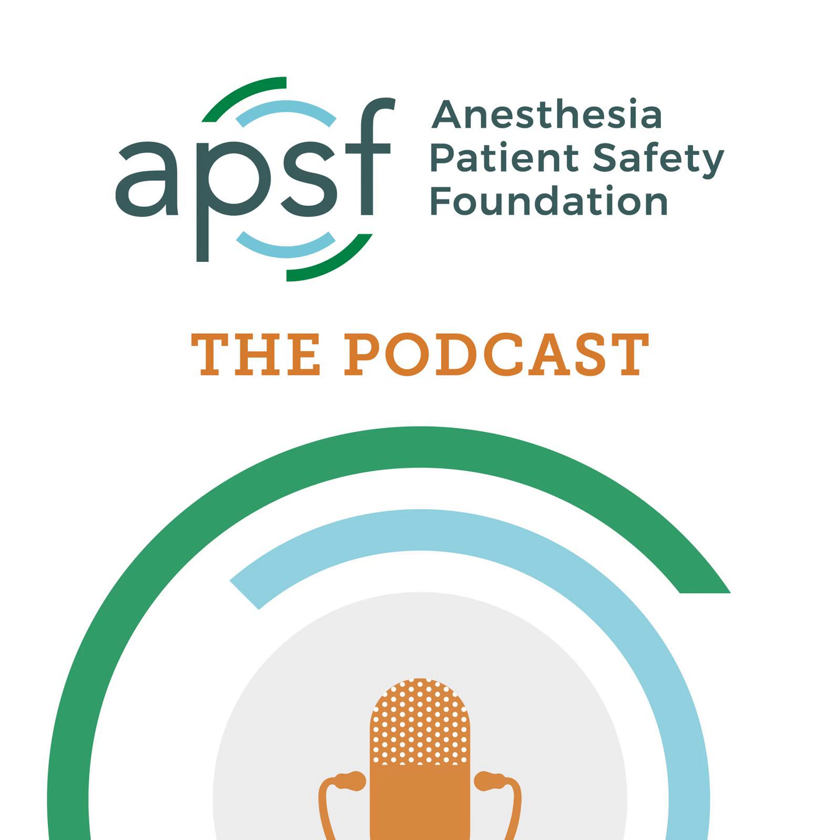Do you have your answer locked in yet? Are you ready? Today, we will be talking about the Laryngeal Mask Airway, or LMA. This device may be used as part of the difficult airway algorithm and may also be used as part of routine airway management when providing anesthesia care.